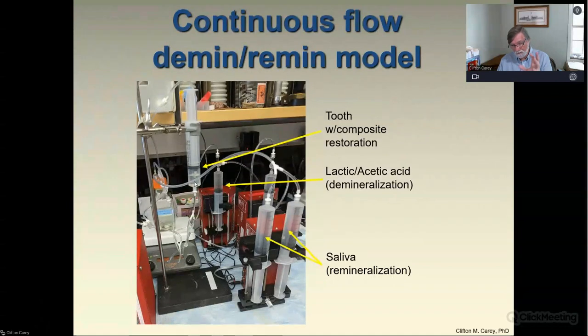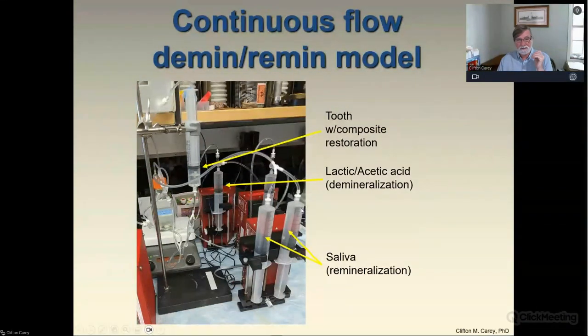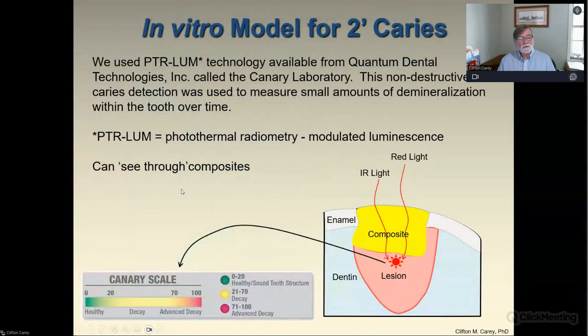We took a healthy tooth that had been extracted for other reasons, probably orthodontic reasons. We drilled holes in it and filled it. And I didn't do it. I had one of our clinicians do the filling, adding the restoration and curing it. And so what we found was very interesting.